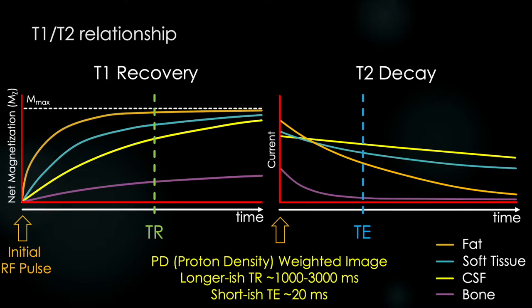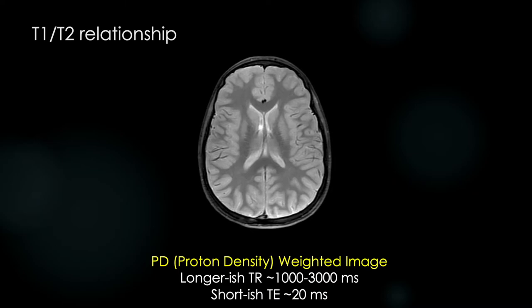Here's an axial slice of the brain on a proton density weighted image. We don't use this sequence a lot in specialties outside of musculoskeletal radiology, but there's something a little off here. Soft tissue is a little denser than water, and you can see the brain cortex is very bright and hard to differentiate from the CSF along their shared edges because they're so similar in signal. The white matter is darker than the cortical matter and CSF — white matter contains myelin, which is fat, so it's less dense and therefore darker. When looking at a joint, PD is pretty good at differentiating cartilage from surrounding tissues such as subchondral bone and fluid within the joint, so it's found a nice niche in musculoskeletal radiology.